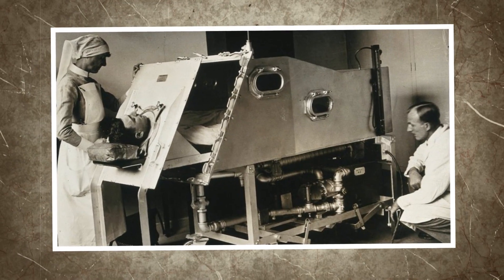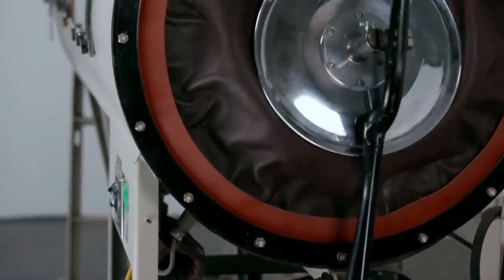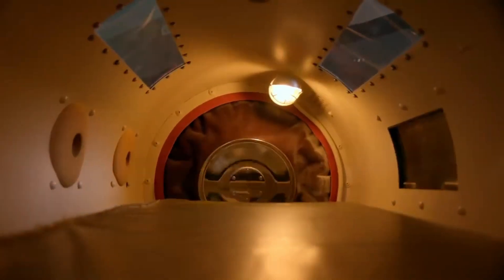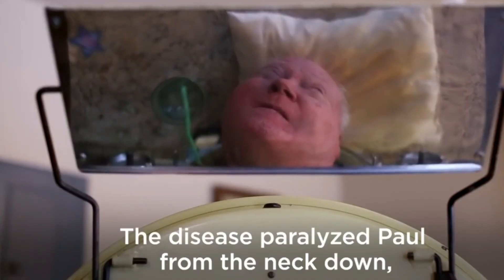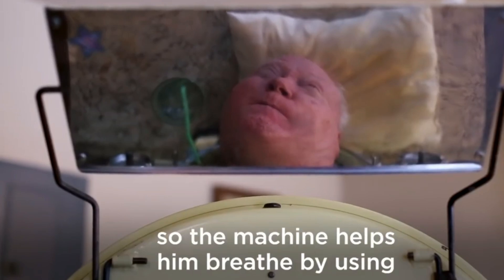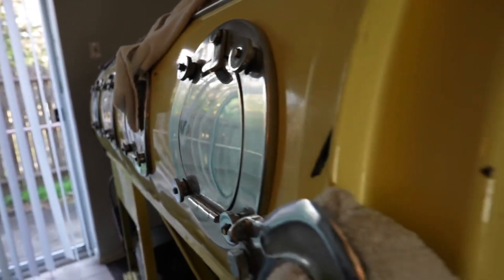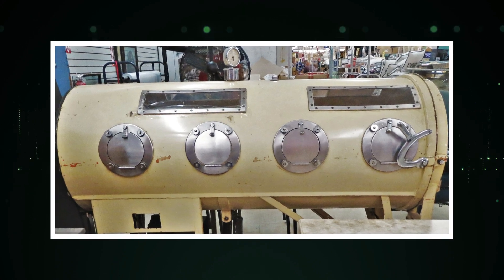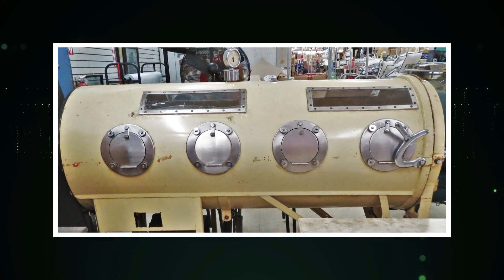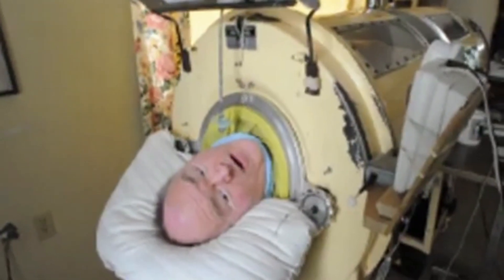The early versions of iron lungs were operated by hand-cranked bellows, but later models used motorized pumps regulated by sophisticated controls. The pressure inside the chamber had to be carefully monitored and adjusted to ensure the patient's breathing was optimal. While iron lungs are now largely obsolete, they played a crucial role in the development of modern respiratory treatment, paving the way for positive pressure ventilators and other advanced devices.